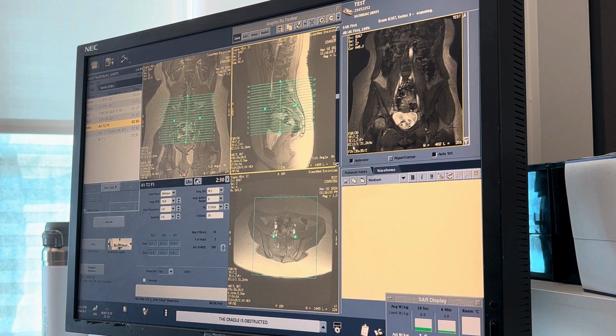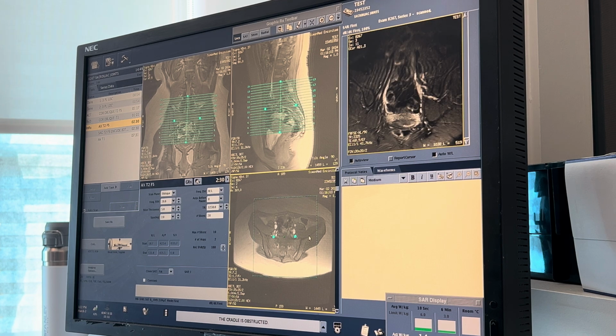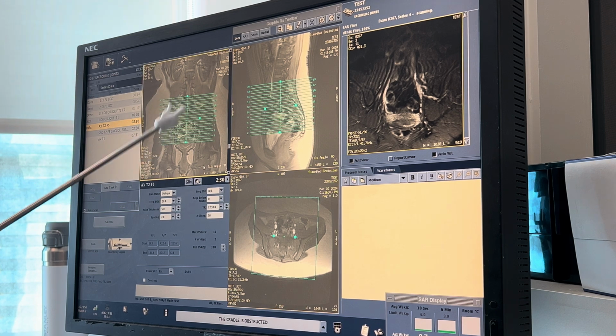Okay? So now, in the axial plane in particular, if you want to angle this, you can, maybe a slight nudge to the right. If not, it's not going to make that big a difference. So the other way. Yeah. There you go. Okay. So now, over here, I do want you to angle with that spinal canal again.